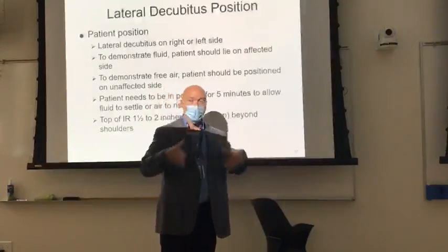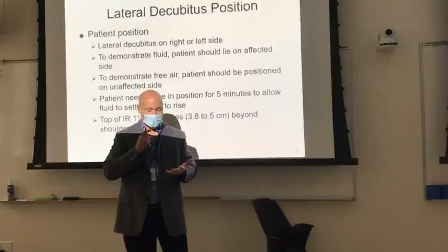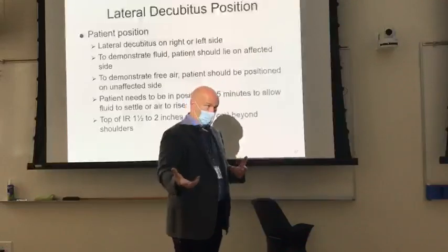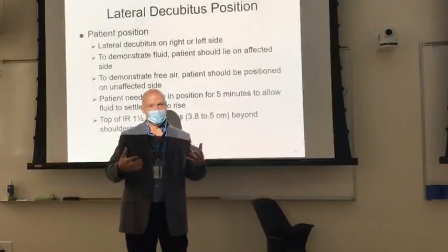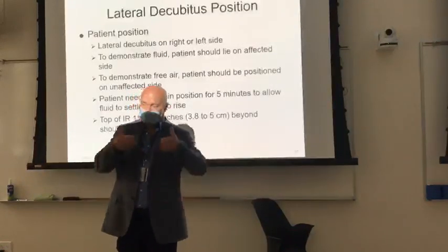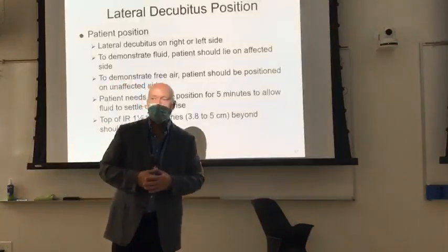You've got the bronchi come down and split, and then in addition to that, you've got the sternum, you got the spine, you got all those fluid-filled structures that are tough to penetrate and tough to separate, and then you put something like air on top of it. It's going to make it very difficult to see the air. Okay. Plus, you got the trachea, the bifurcation.